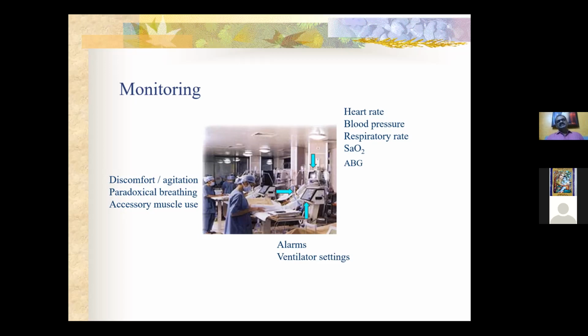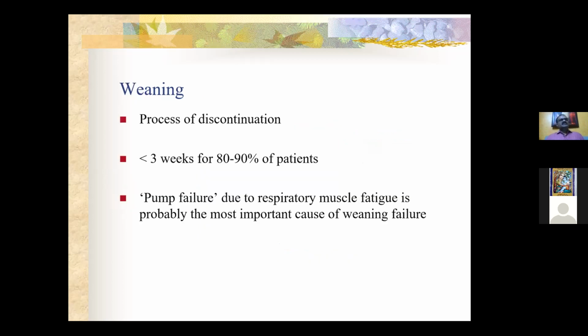You should change the ventilator settings depending on the alarms. So you should know what the alarms are showing and what they point towards. That is what I just showed through some slides. I know it's not adequate, but you have to go and see what is happening. Then I will go through the weaning part also, the process of discontinuation, which usually happens within 3 weeks in more than 80 to 90% of patients.